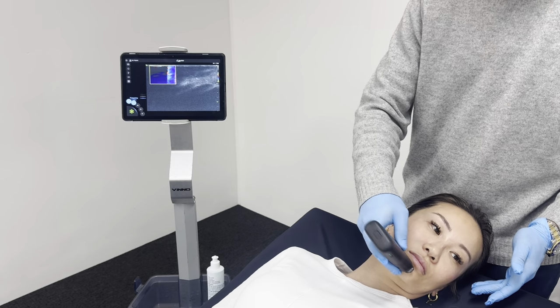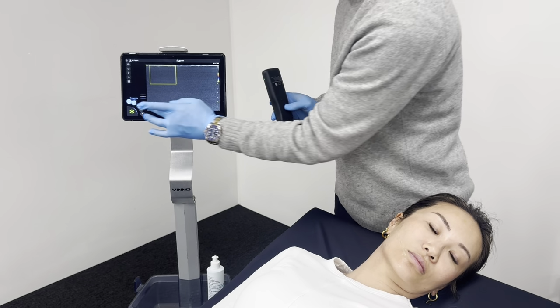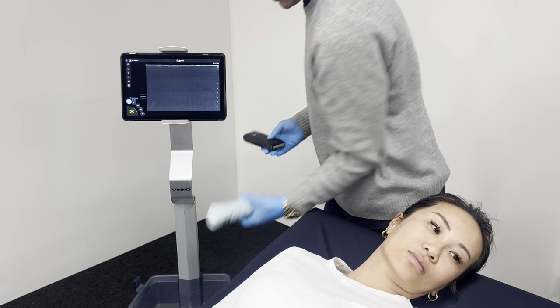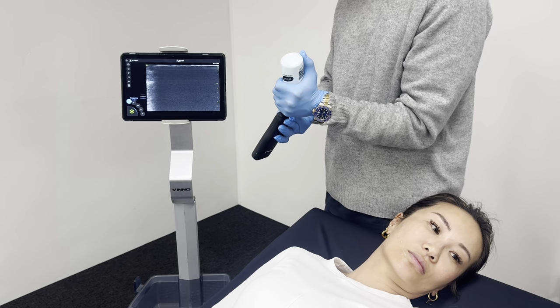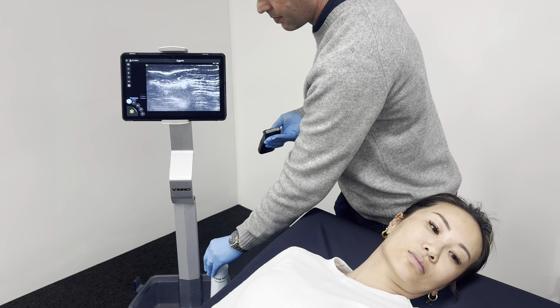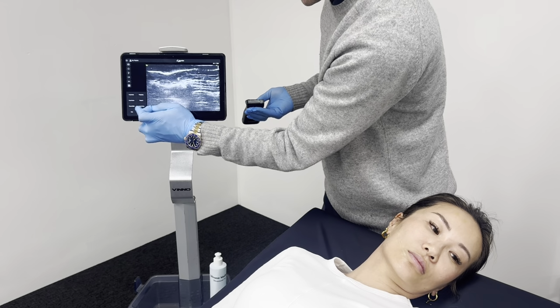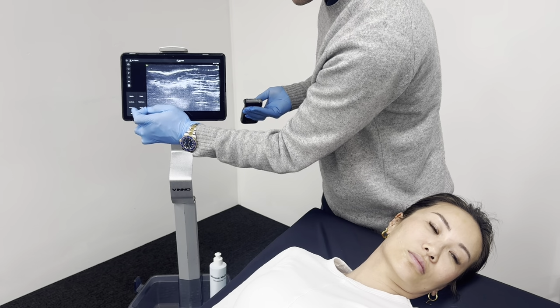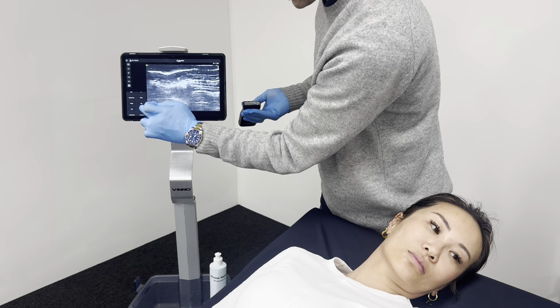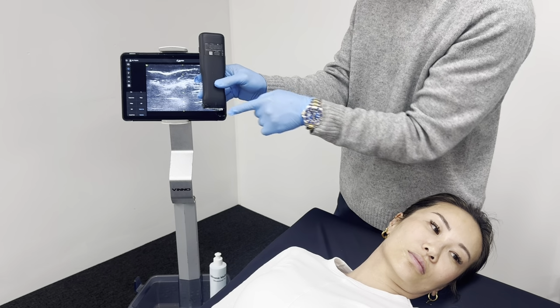We can also have a look at the chin. So if we bring the probe into, I'm going to take colour flow off just to make it easier to see the 2D structures. A little bit of extra gel. If we put the probe in the midline, you can actually put a centre line on your image. So if you put this up here, these 4 little squares down there, bring it down to the lower part of the menu and choose centre line. That'll give you a marker that corresponds with the marker on your probe.